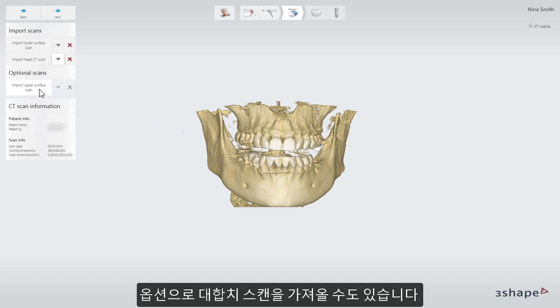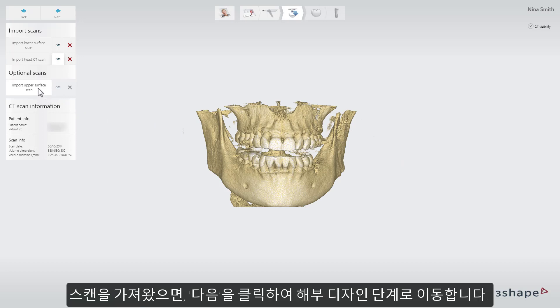It is optional to import the antagonist scan. Once the scans are imported, you will move directly to the Anatomy Design step by clicking Next.